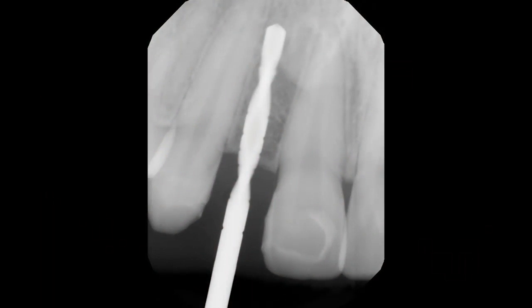A pilot drill was centered between the teeth adjacent to the edentulous site. The osteotomy was positioned approximately 3 millimeters palatal to the facial aspect of the adjacent dentition to allow for the best aesthetics and enough facial room for a custom abutment and implant-retained crown. The mesial-distal angulation of the drill was checked with a periapical radiograph. The diameter of the osteotomy was slightly smaller than that of the implant chosen for this case, and a depth of approximately 13 millimeters was established.